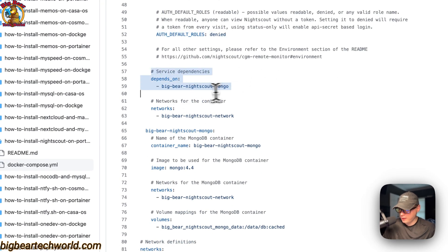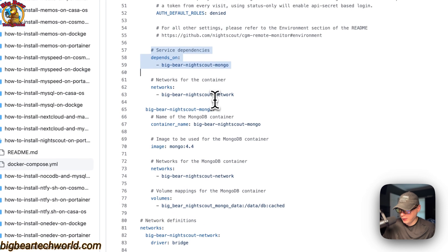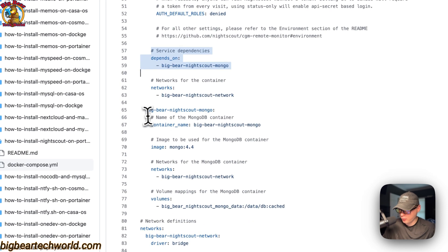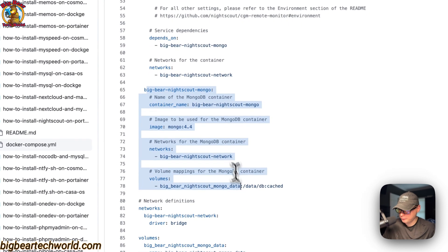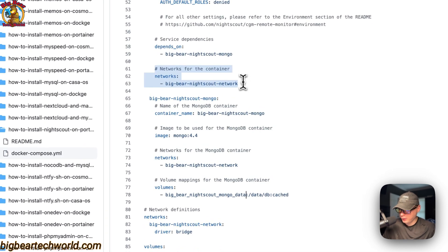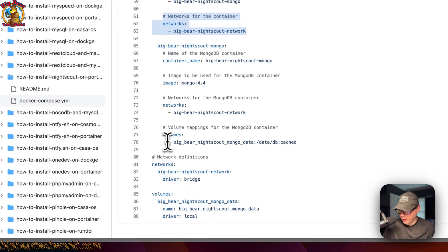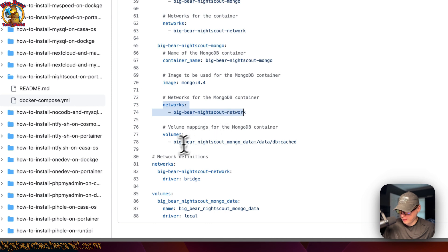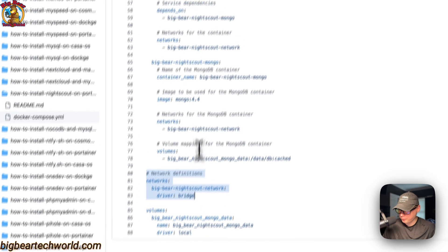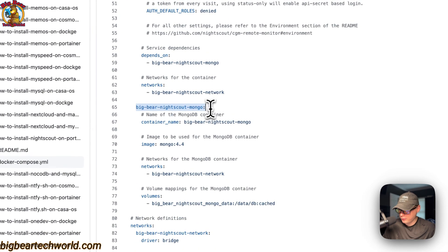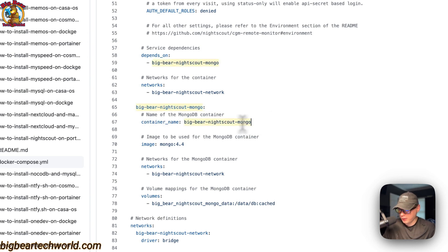The Nightscout service depends on the 'big-bear-nightscout-mongo' service, which is defined right here. The networks for the container are set to 'big-bear-nightscout-network', which is also defined further down.